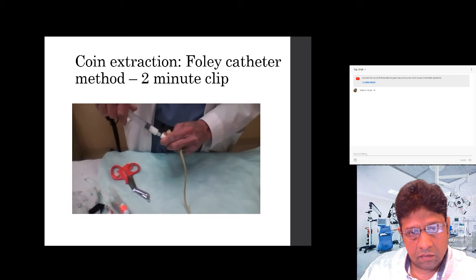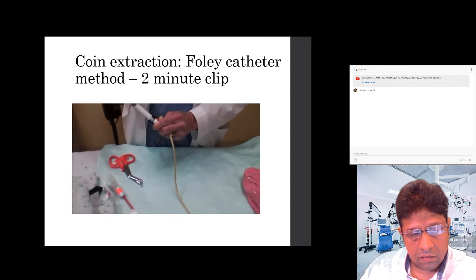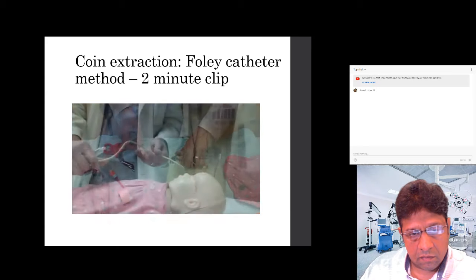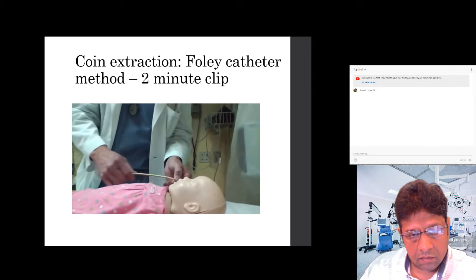Now, when you're getting set to do this, one of the things you can do is fill the catheter with some barium and then pull it back out. And this will leave a thin stream in there, so that if there's any question of where the catheter is, you can take a quick x-ray and the Foley catheter will show up because of the lining of the barium that's in it.